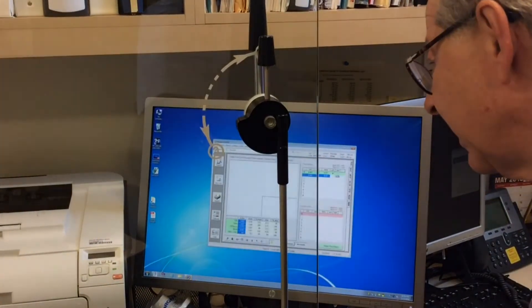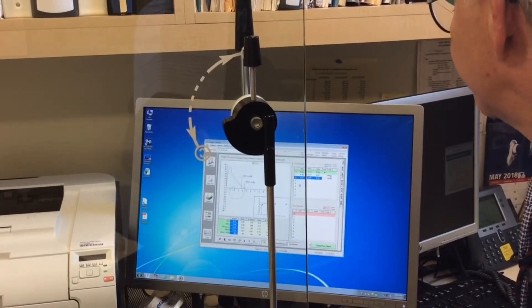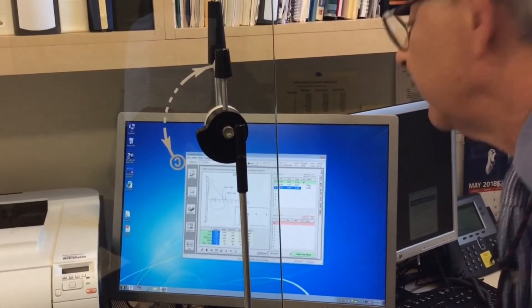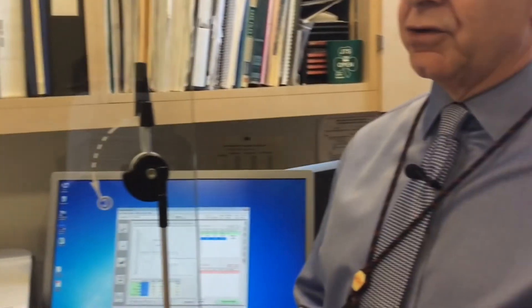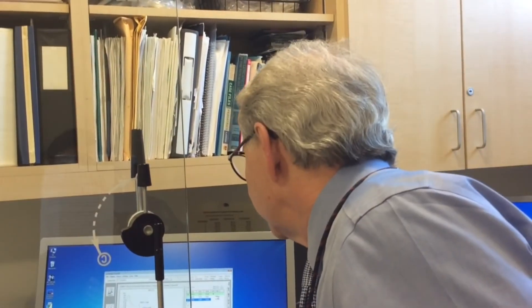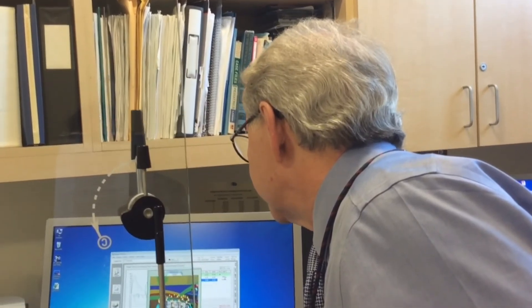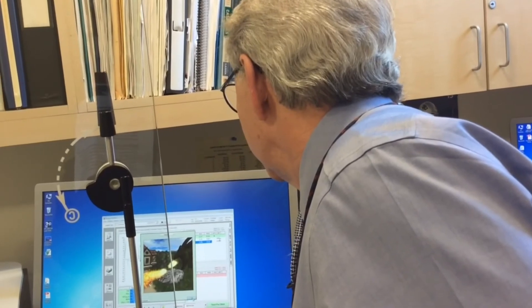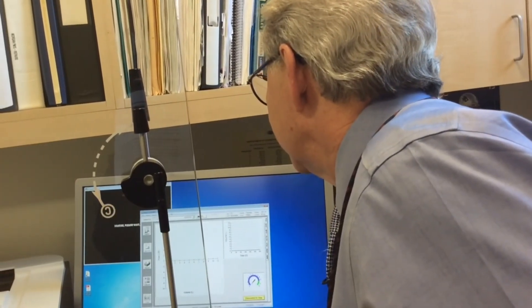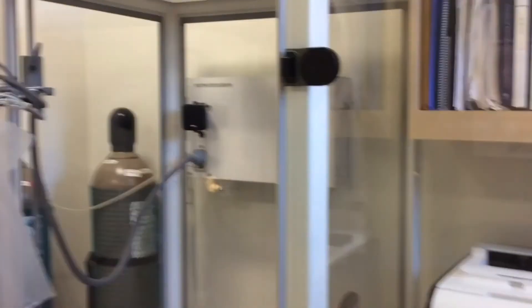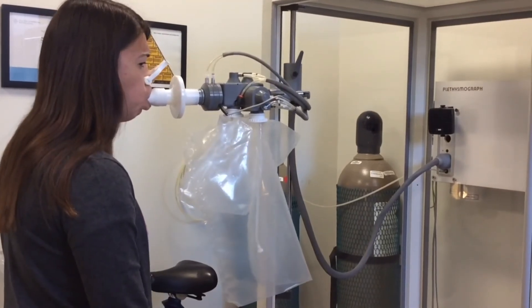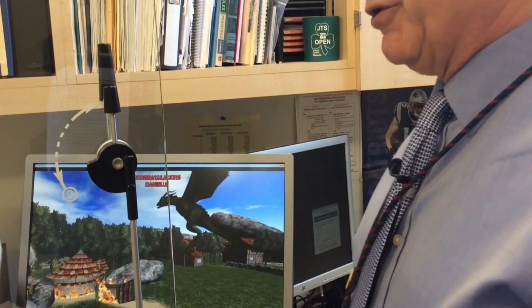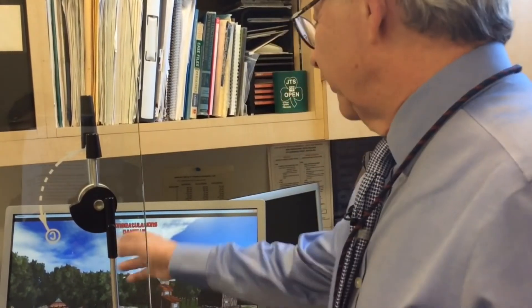She did a little bit better on that one with her vital capacity. We're also going to make sure that she's not dizzy — how do you feel, are you okay? We're going to do at least three attempts; with most children it can go three to eight. I like to let them rest between each one so they don't feel lightheaded. Now you're the dragon and you're going to burn that castle down. Just breathe easy, whenever you're ready, big breath in, fill it up all the way, hit it hard, push hard, go, go, go, go. Keep going, squeeze it out, stay with it, then a big breath in when you're empty. Nice job. Danielle did pretty well with that — take a little rest. She gets some fireworks for that too.